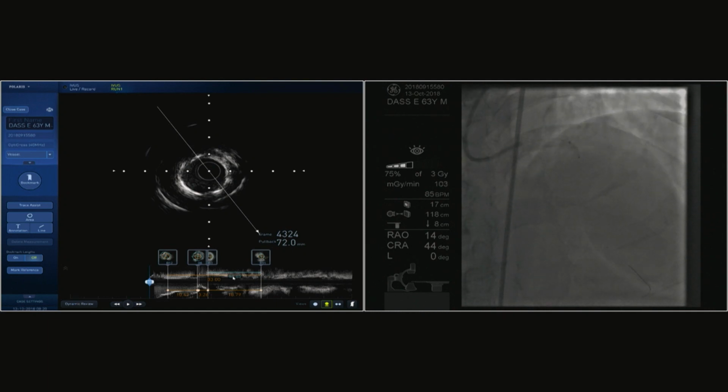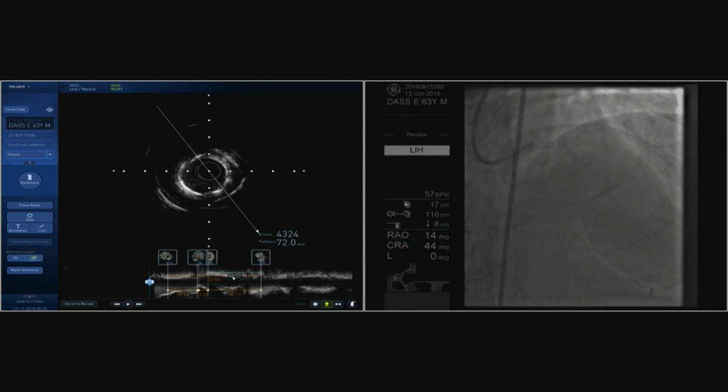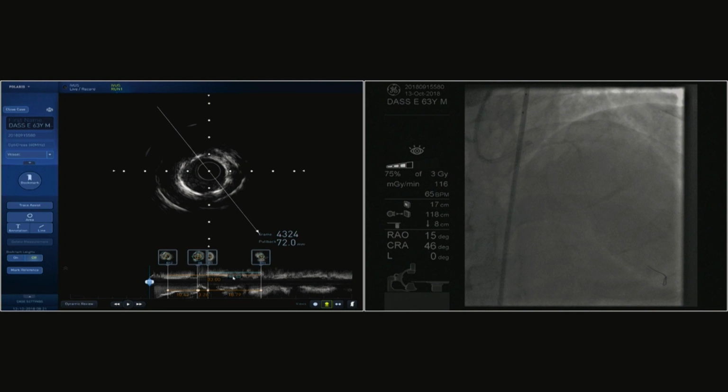So Vijay is asking, why do you want to go so slowly in inflating a Flextome in the left main? Because all these lesions are best very gently dilated. When I dilate them rapidly, sometimes I've seen perforations, and there's a sudden give way, and I don't like that. Typically, I am slow on inflating these and very gently to higher pressures.